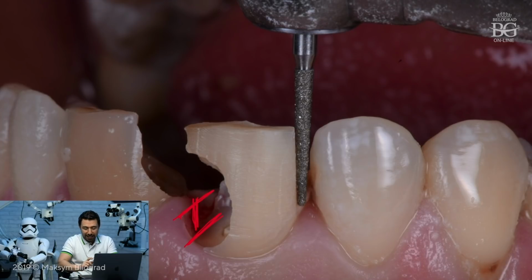The good thing in that case was that this defect was not at the bone level, so the bone was slightly below because of the caries defect, and the bone was redesigned by the immune system of the patient actually, and it gave us some benefits for rubberdam isolation, because the rubberdam isolation in this case was super difficult.